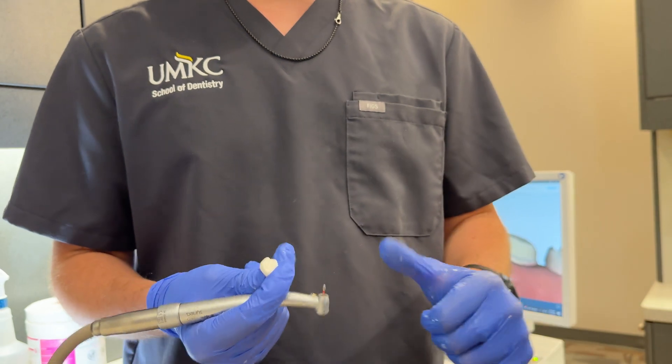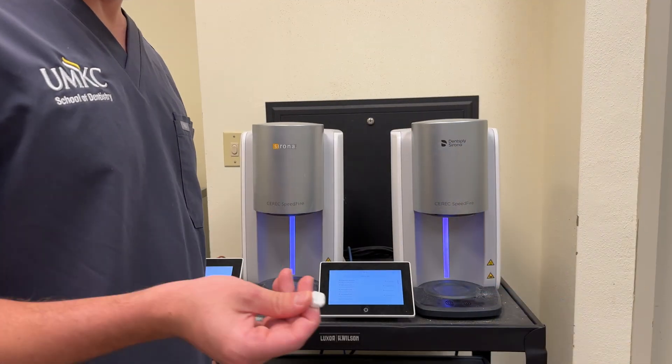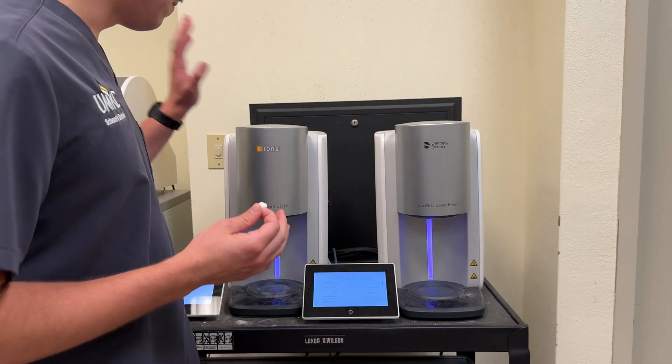That looks pretty much perfect. Now that we've removed the sprue and smoothed it out, we're ready to take it over to our firing unit to finish this crown. We're going to take it back to our milling lab and over to our Speedfire units.